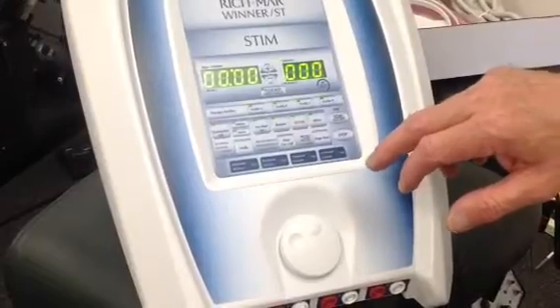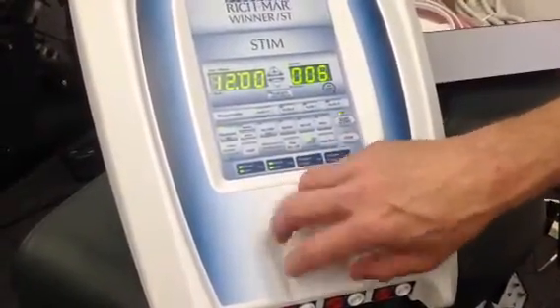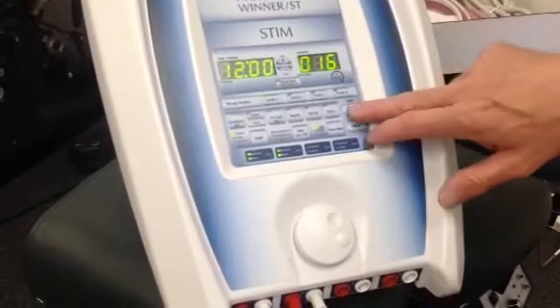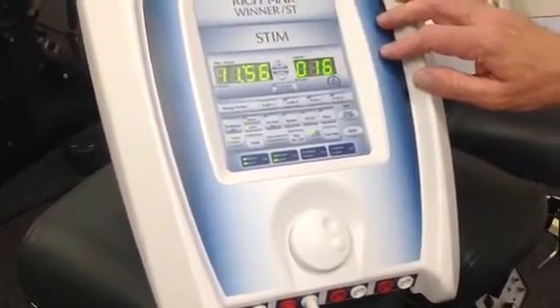No, I didn't do that right, did I? Profile A. There we go. So we turn up our intensity, and when the intensity is to the point where the patient says, I'm good with that, you hit your start-stop button, and it starts to count down.